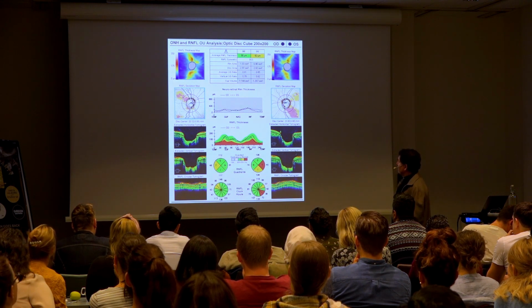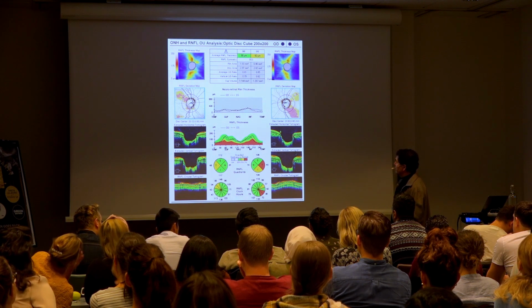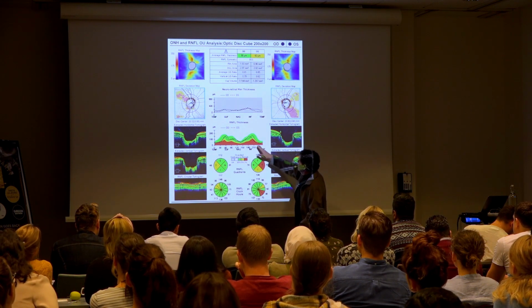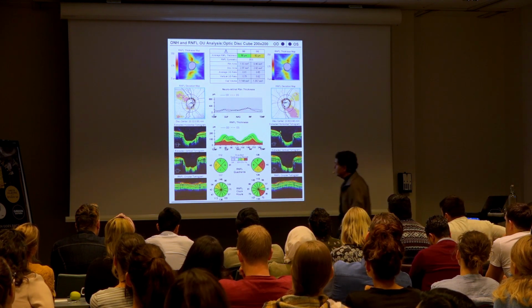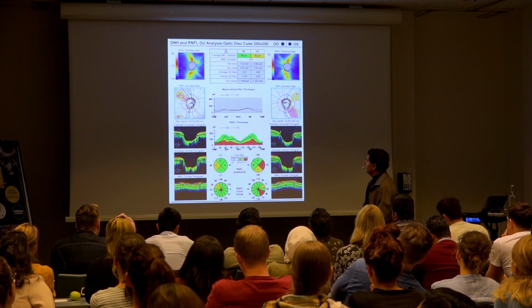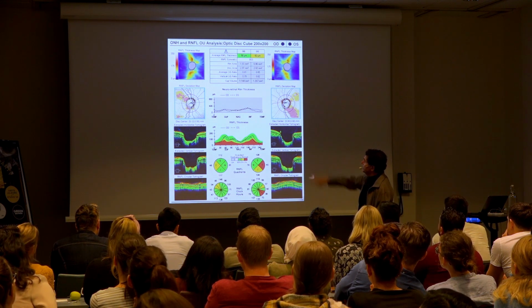So, on one hand, it looks like a very thin rim, and it's kind of dropping into the red region. Now, is there anything else unusual? Look at all the information there.